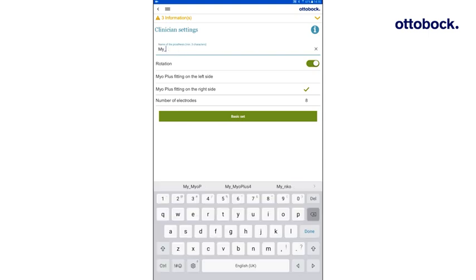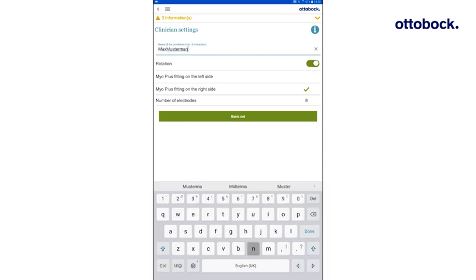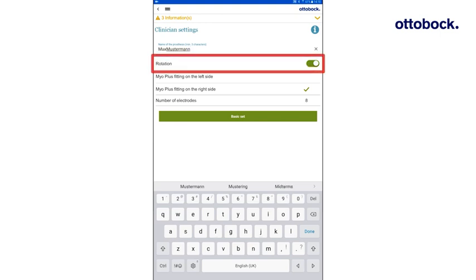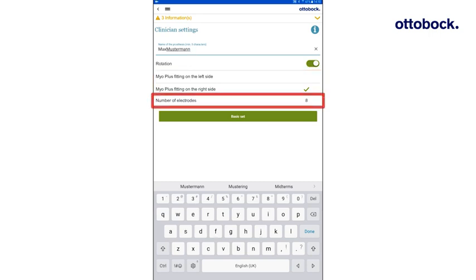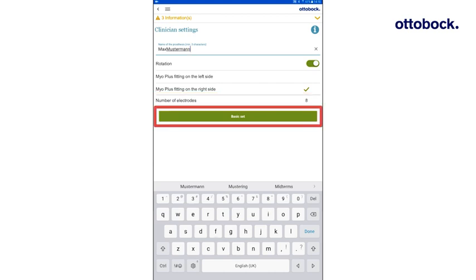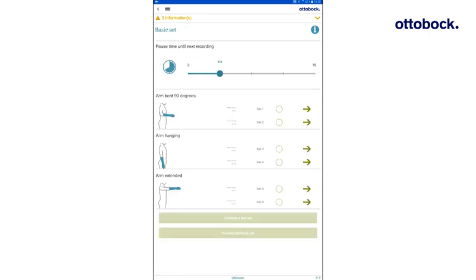Here you can assign the name of the prosthesis. Select if an electric wrist rotator should be simulated and if the Myo Cuff is applied on the left or the right side. The number of electrodes is automatically recognized and displayed by the system. By pressing Basic Set, you will be forwarded to the Basic Set.